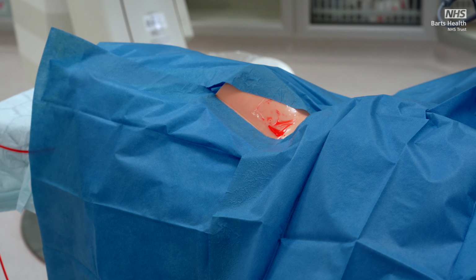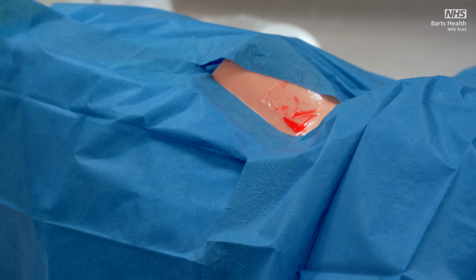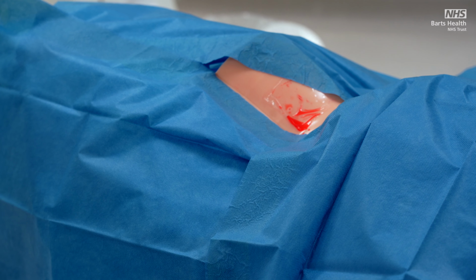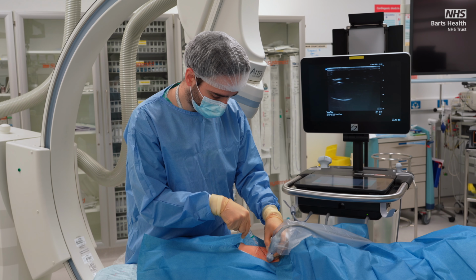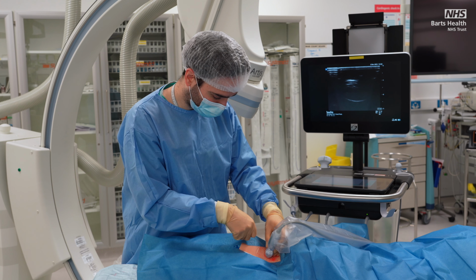The next step is to prepare and drape the patient, ensuring an adequately sized sterile field. Next, use a Seldinger technique to insert a sheath into the internal jugular vein.